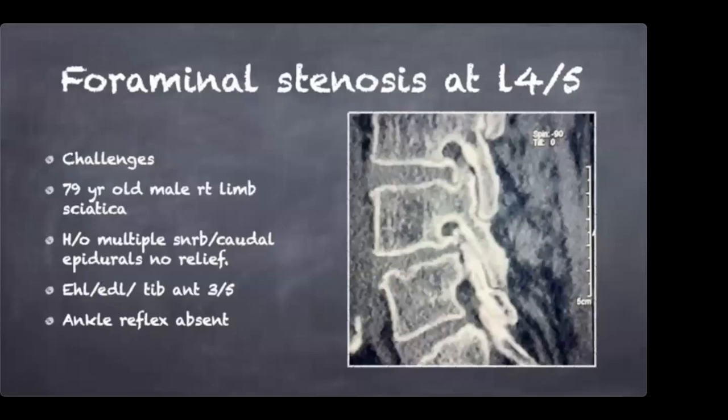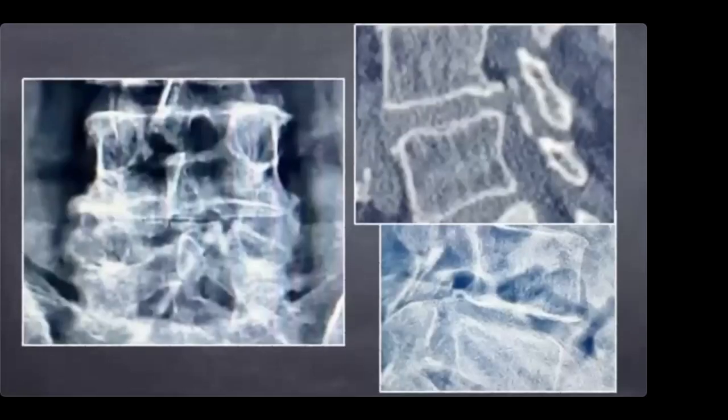And the neurology of the patient has been explained to you. He's 79 years old. He's not keen on any form of fusion surgery. But obviously the option open to a normal person would be to consider a TLIF, the removal of the large hypertrophic right facet, severe collapse of lamina, interlaminar space is less, so you would consider a TLIF most probably.